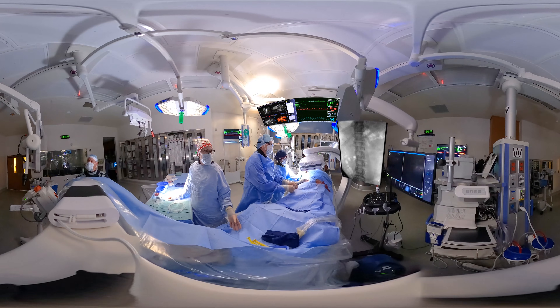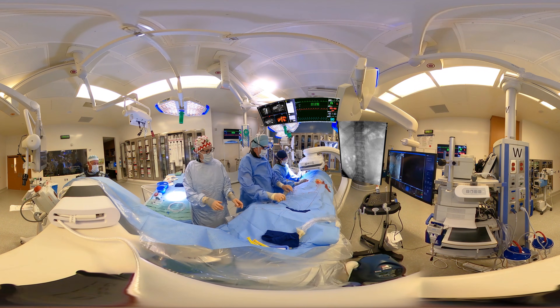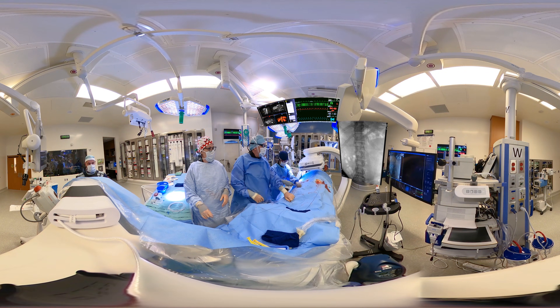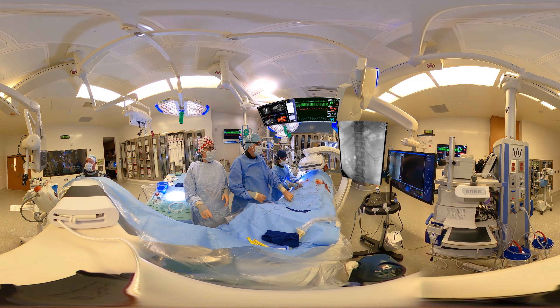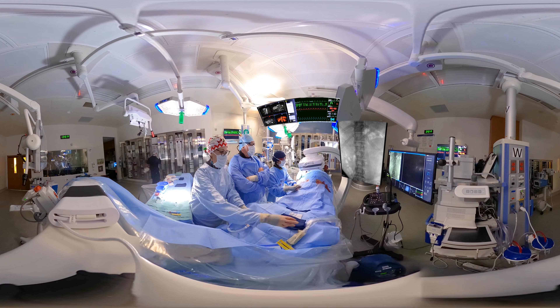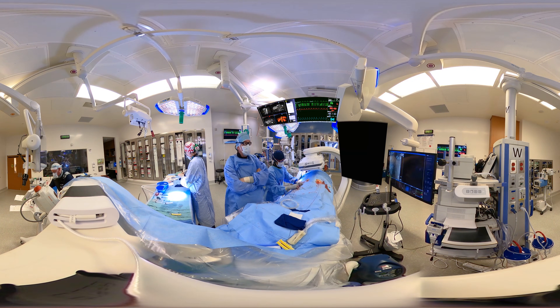Here we're actually catheterizing what looks like the superior mesenteric artery. Most of this can be done without doing an actual aortogram. We'll confirm that this is indeed the correct location. It looks like we're probably in the renal artery, so we're going to reposition. You can see we've pulled back out of the renal artery and we're going to let the catheter reform — this is a C2 catheter we're utilizing. There are two wires up the aorta. We'll move the catheter superiorly, rotate anteriorly, and try to get into the superior mesenteric artery or the celiac artery.